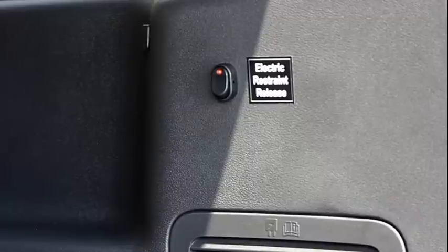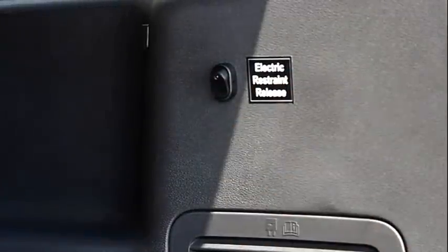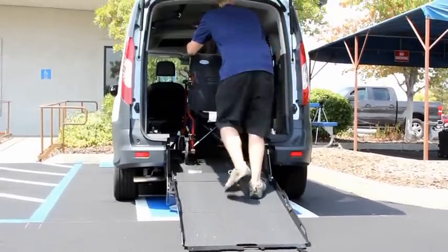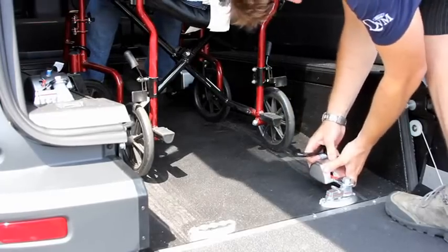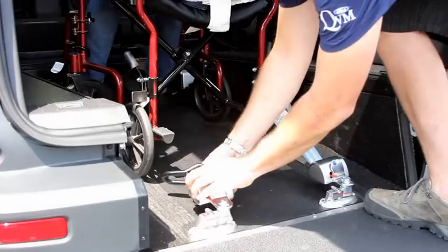To prevent the wheelchair from rolling backwards, flip the switch to the off position. This will lock the belts in place. Roll the chair fully into position to ensure the belts are locked in place. Insert two retractors in the rear holders and attach to the wheelchair in appropriate places.